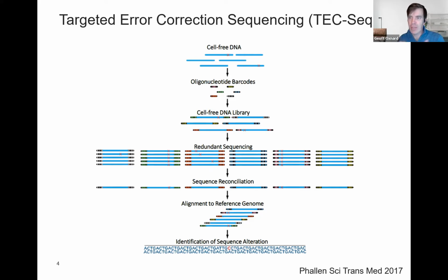You've nicely called out with a fresh specimen, you can sift through the artifact and find that signal. And so it's allowed us to dive deeper into specimens and get more yield out of these things. And just to back up to the 30,000 foot level, it always astounded me during my PhD that I could make a primer that was 20 base pairs long and find any unique gene in the entire human genome or any genome with that, right?